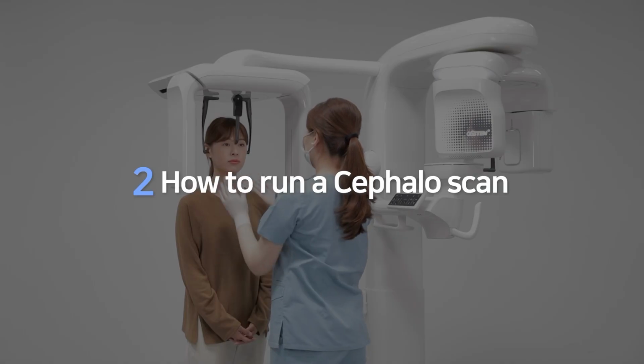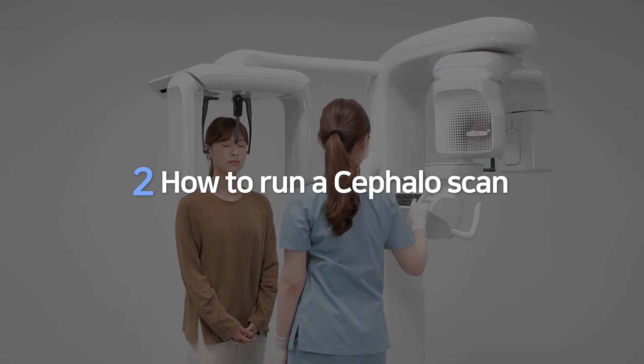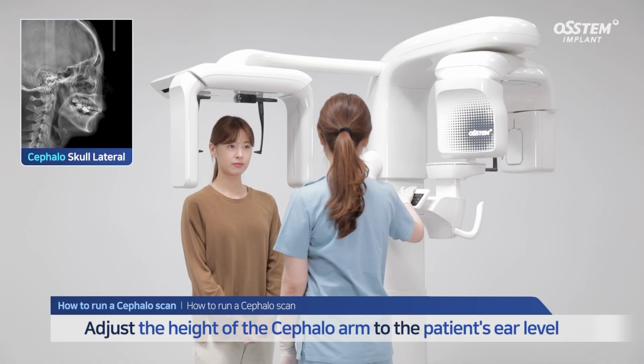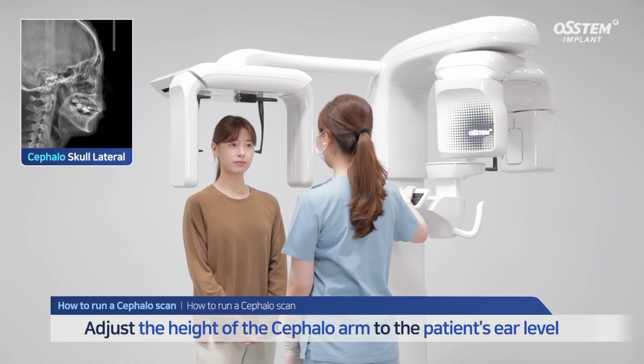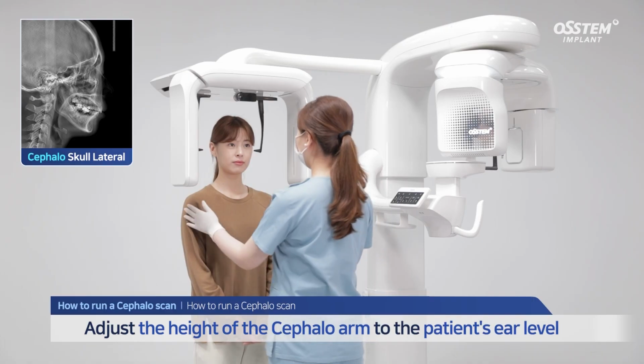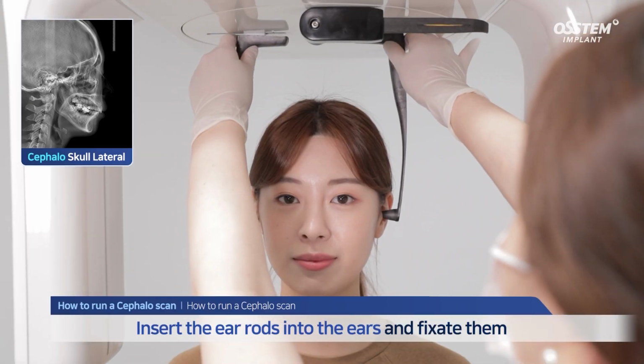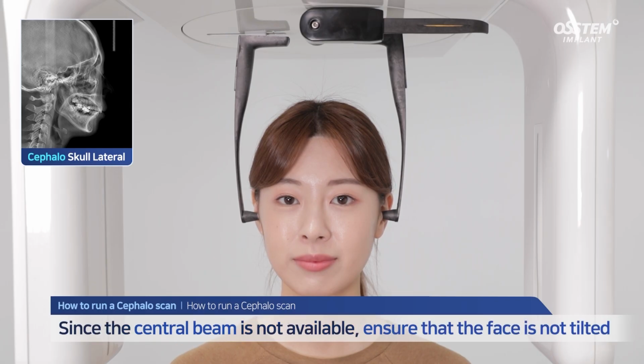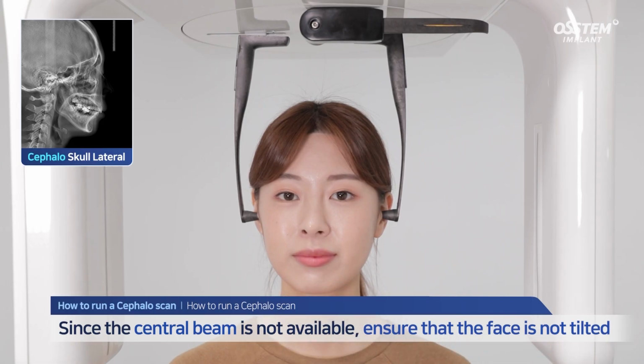The second part is about how to run a cephalo scan. Let's take a look at the cephalo skull lateral scanning position. Adjust the height of the cephalo arm to the patient's ear level. Insert both of the ear rods into the patient's ears and fixate them. As the central beam is not available, make sure that the face is not tilted sideways.